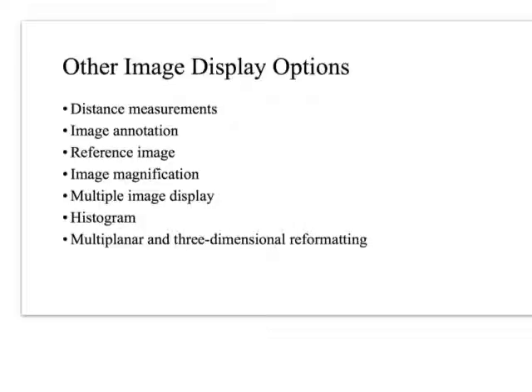So these reference images are very helpful, especially if we're doing spine work, because it allows us to see, okay, that we're at the level of L whatever here. Whereas if we didn't have this reference image, we'd have to fly up and down the spine and try to orient ourselves. It can be very difficult. So a lot of protocols will call for those.